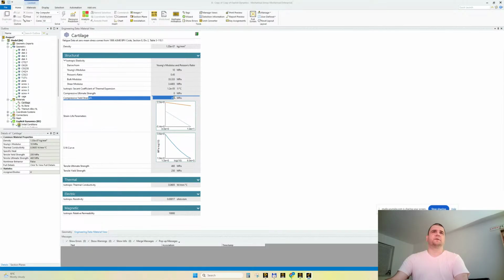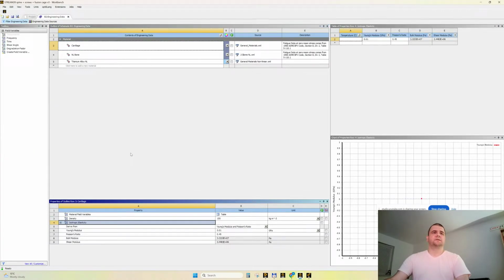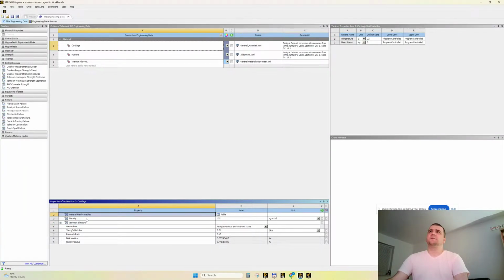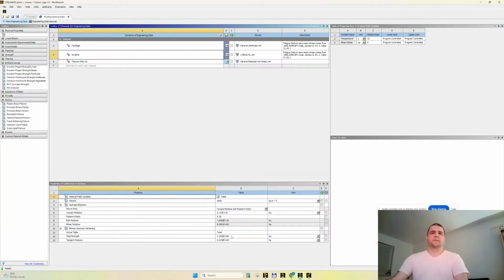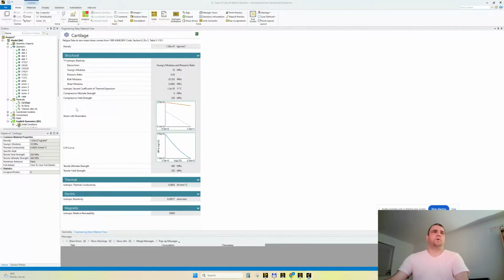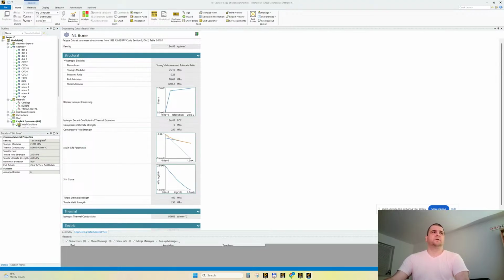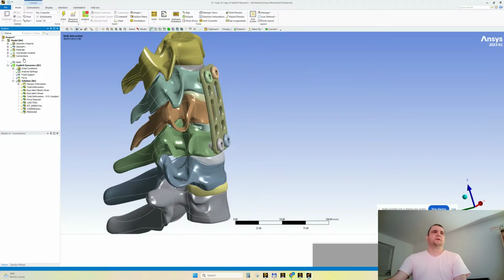These ones are default, a remnant from steel. You know what, let's delete them. Cartilage, isotropic elasticity. How do they appear there? Because they are not here. There is no fatigue defined. All right, the nonlinear bone is this one. I have estimated some tangent modulus, like this. So how and why do we have this? They do not exist in engineering data. Why do they exist? We sincerely do not care.